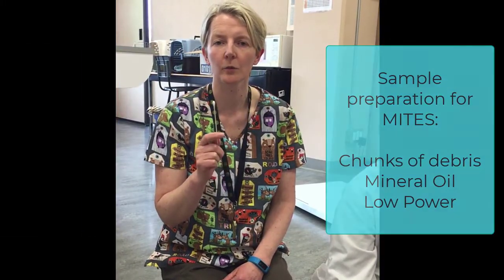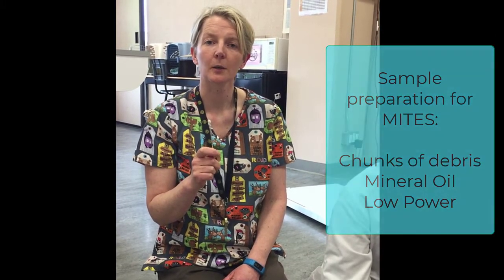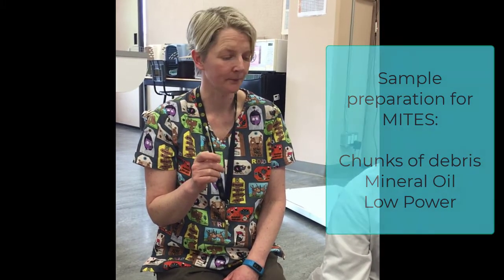There are two different things that we might want to look at when we're looking at ear cytology. The first thing is we might be wanting to look for ear mites. And when we want to look for ear mites, we want big chunks of wax from the ear canal, and we want to mix it with mineral oil, and we're going to look at it under low power.